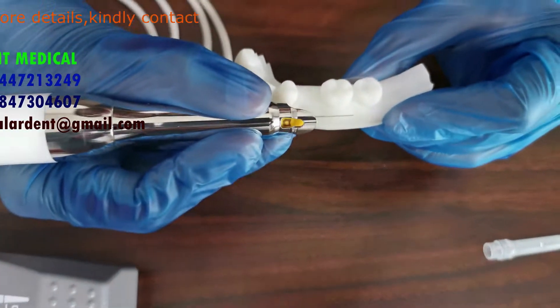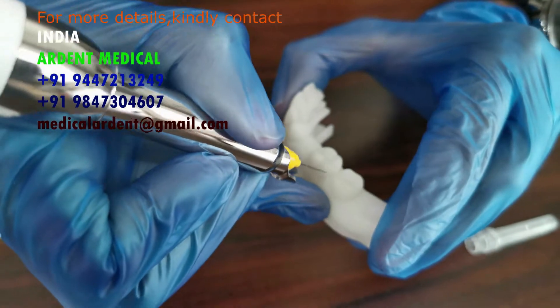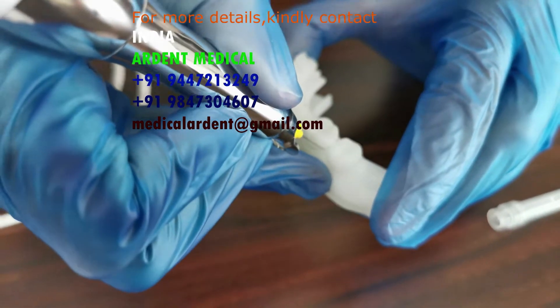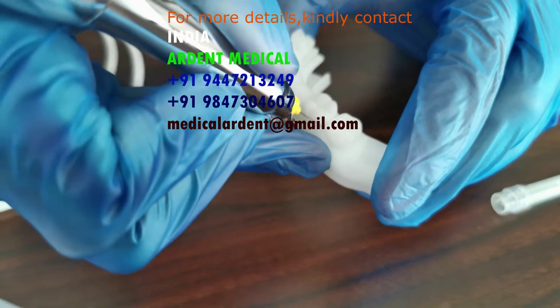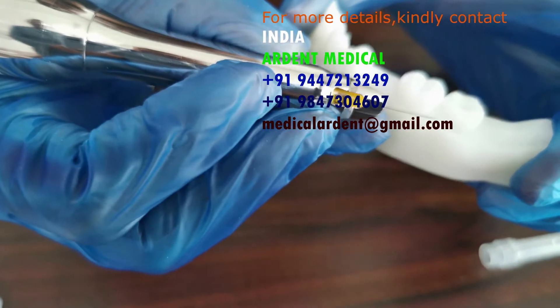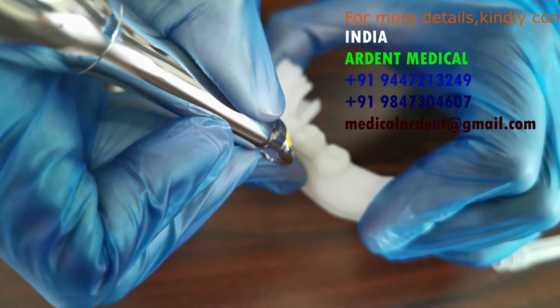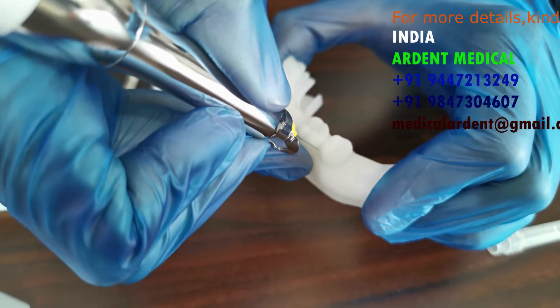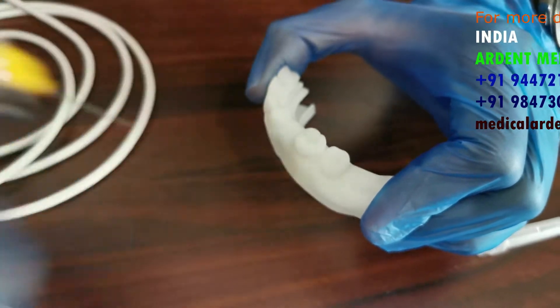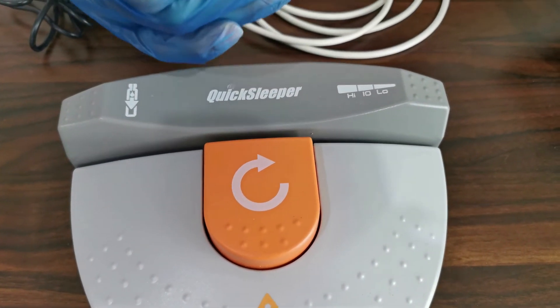After step one is complete we take out the needle and orient it such that we are going to penetrate the cortical bone — that is the first and major difference from step one. In step one it is a very shallow entry just before the periosteum; in step two the needle is in contact with the bone. Once you have kept it at an angle of 40 degrees to the long axis — this is in particular for the mandibular teeth — we press this particular foot pedal which enables the needle to rotate and penetrate through the cortical plate into the cancellous bone.